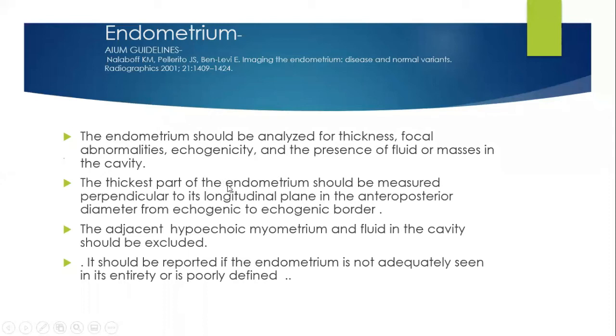The thickest part of the endometrium should be measured perpendicular to its longitudinal plane, in anterior-posterior diameter, from one echogenic line to another echogenic line. Very, very important. Remember this.